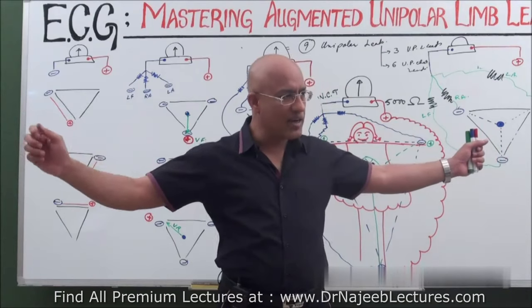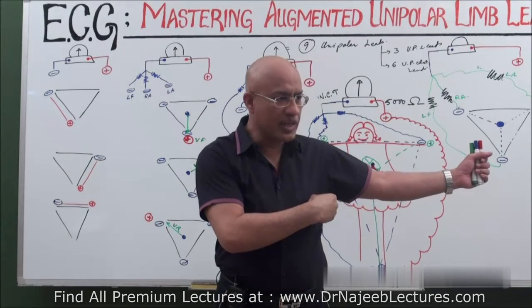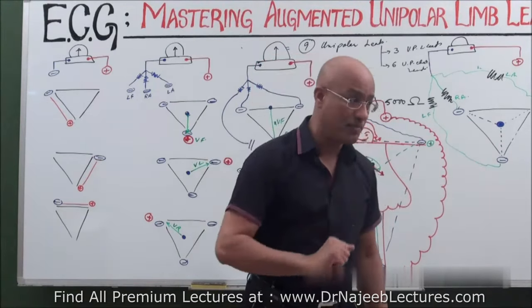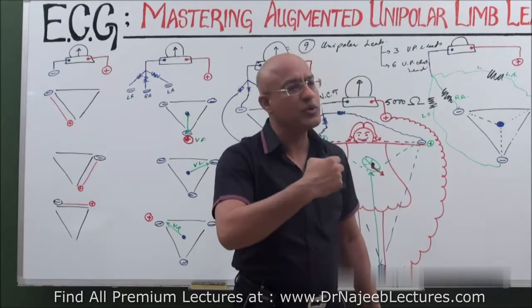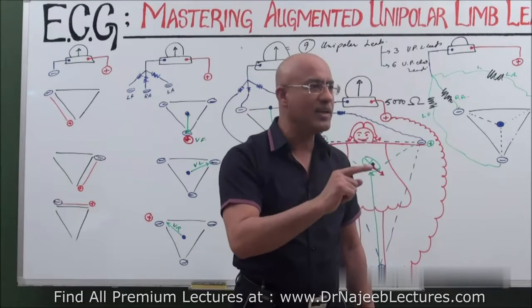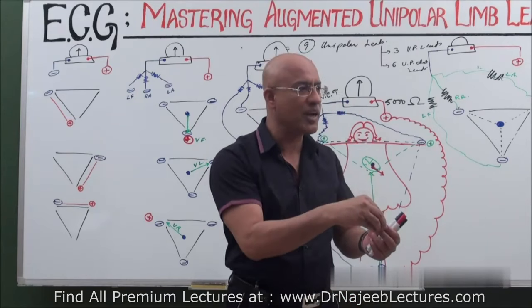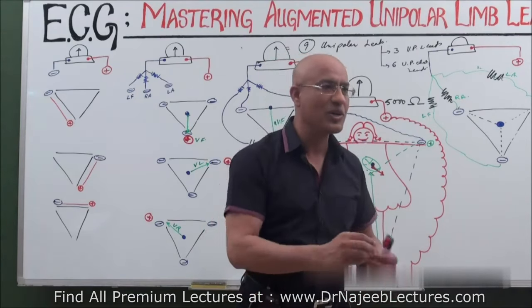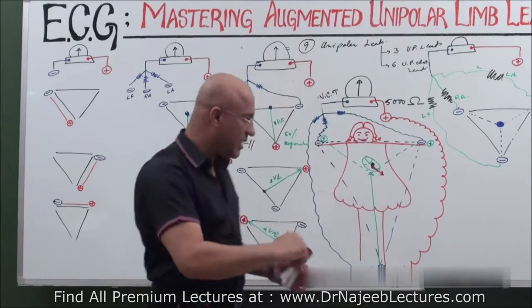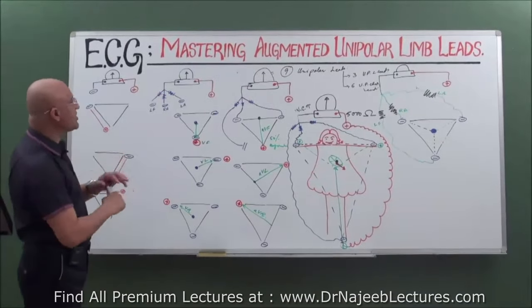You are getting it? Yes. So negatives are on the limbs, and the positive electrode is on the chest. So do you think negative and positive at some point will neutralize? No. So the voltage issue does not come with the Wilson system when you are recording chest leads. The voltage issue comes when you are recording limb leads, because wherever on the limb you put the positive electrode, there is a negative electrode there to cancel it out partially. Am I clear? Yes. Clear? Right? So now, any question up to this? Here you can see another thing.